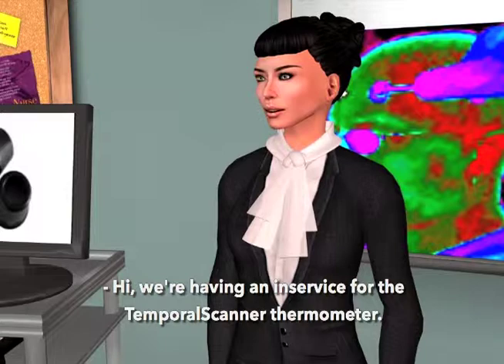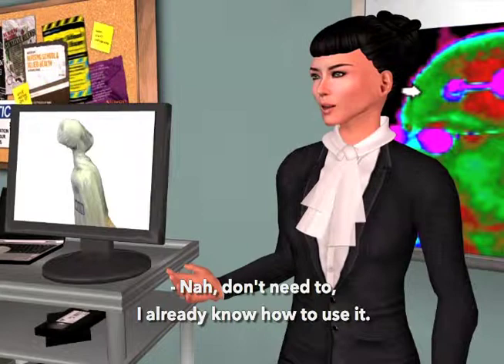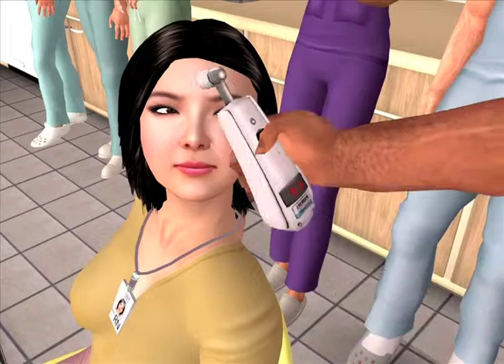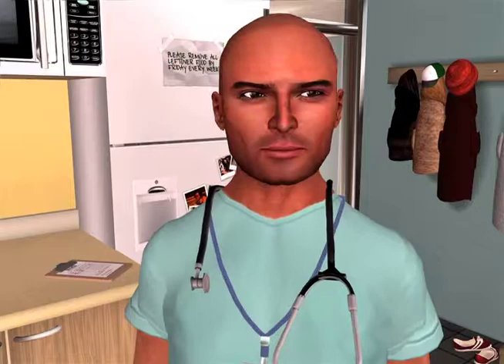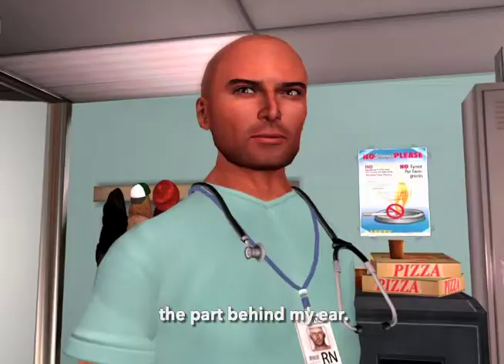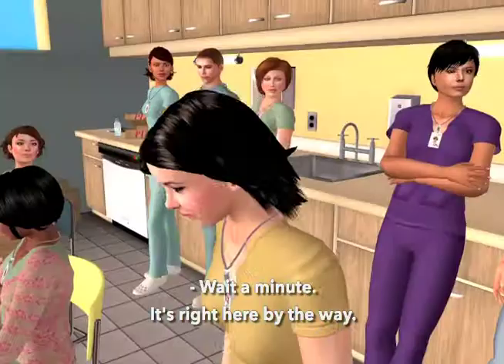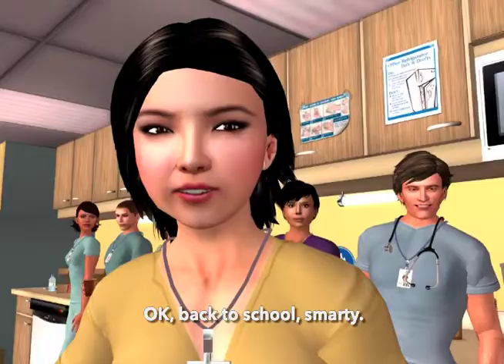Hey, what's up? Hi, we're having an in-service for the temporal scanner thermometer. Will you join us? No, don't need to. I already know how to use it. Would you just quickly demonstrate for me before you leave? You got it half right — the part behind the ear. You got it wrong. Okay, back to school, Smarty.